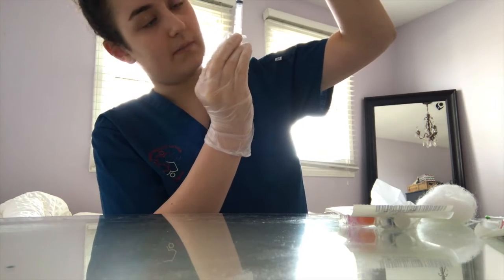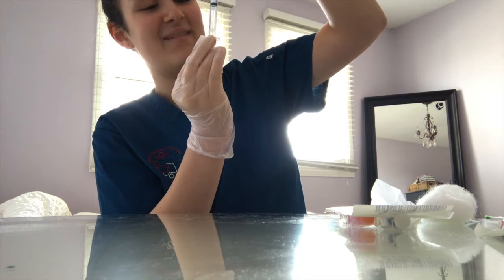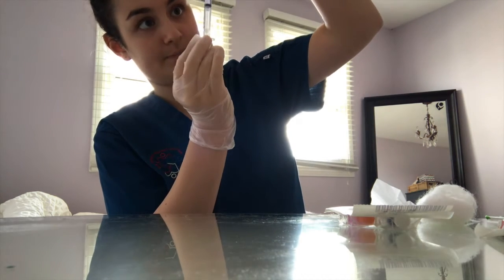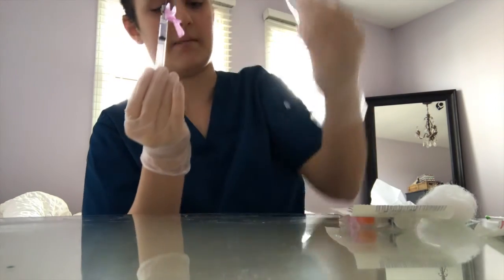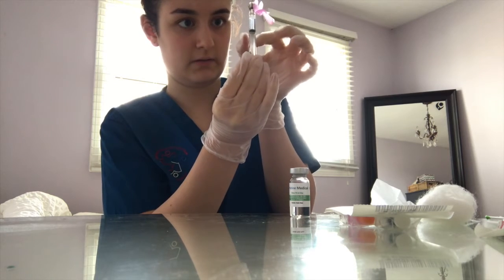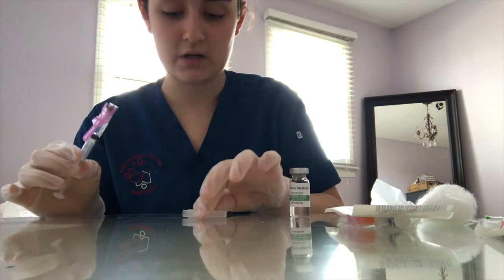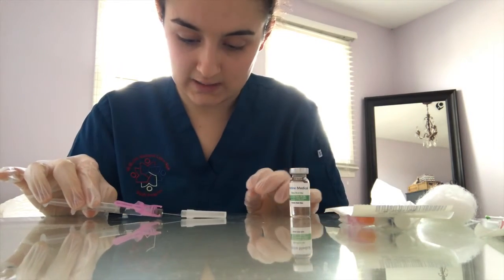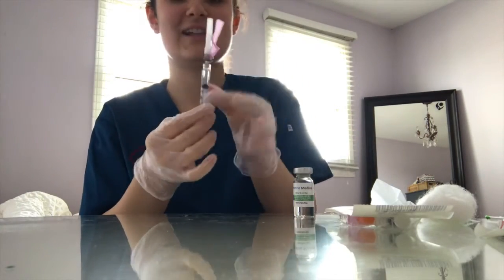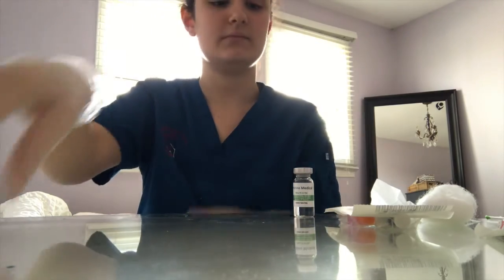Then you want to look for the top line of the plunger. You can't see, but I'm using the top line and not the bottom or middle. I'm using the right line, okay, people? And out we come. There's bubbles, so I'm flicking the bubbles. There we go. You're supposed to do a trick where you don't use your hands, but I'm horrible at that, so I've put it on locked. And let's say that I had a good label and I taped it on, and that's done.